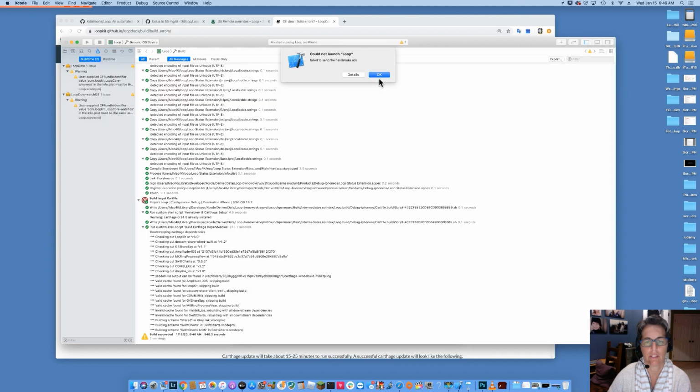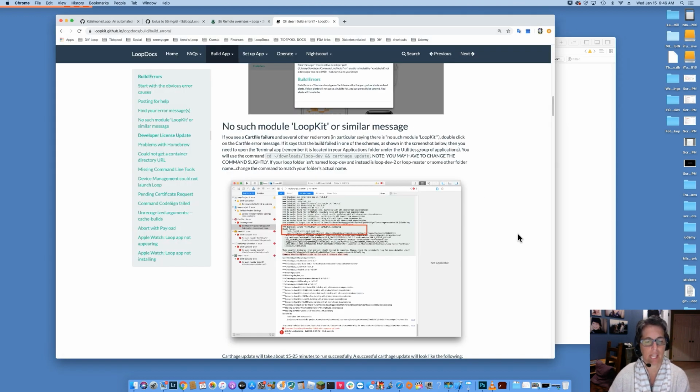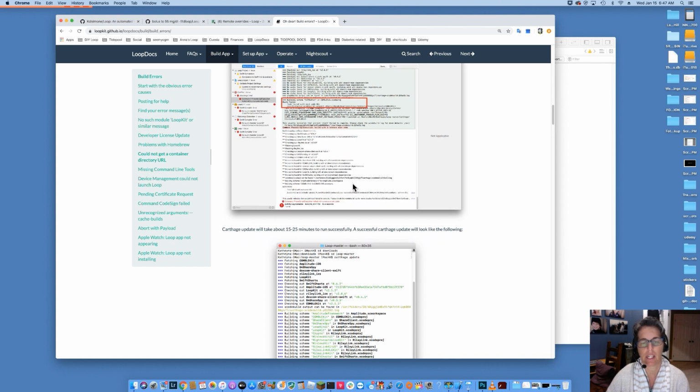Okay. Cancel. Okay. If there was another build error that showed up, I would click on the Report Navigator tab. I would go back to the build at the top row here, and I would read what the error message is. I would take that error message and start looking first, where's the error message? Go here and look at these examples that are posted where there's a red box around the things, and look for the type of error message that's there.